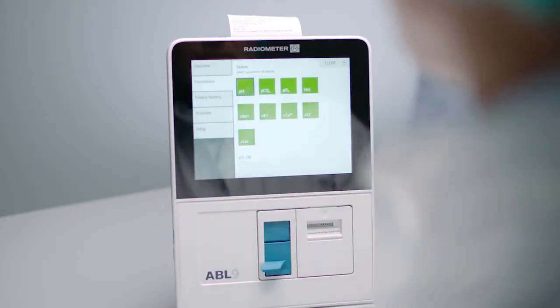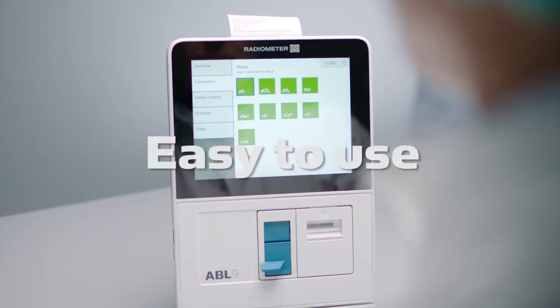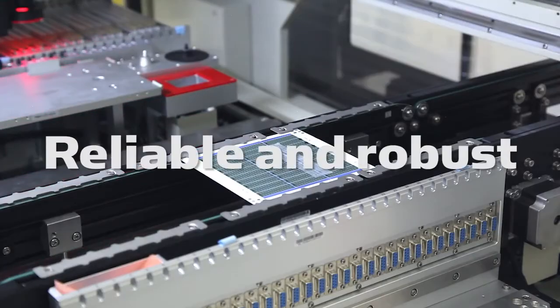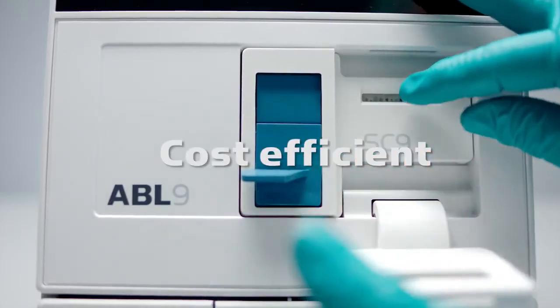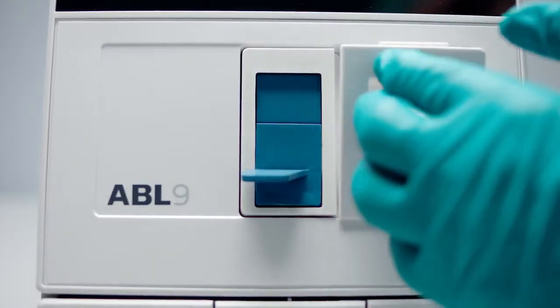What they have succeeded creating is an easy-to-use, reliable and robust, cost-efficient blood gas analyzer.